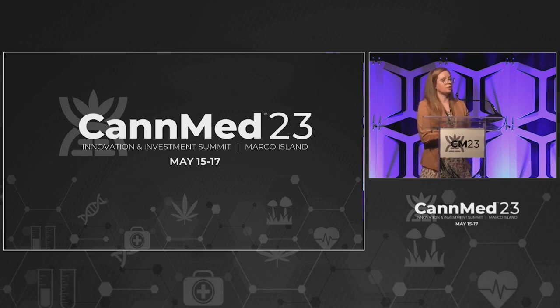And I think that's why more research ultimately needs to be done before we just put a ton of RadSource product on the market: what is it doing to the product? Make sure it's actually solving the problem rather than just tricking the test, because there are dangerous molds that could be present. Aspergillus could be present, and RadSource could allow that colony not to grow, but the Aspergillus then broke down into mycotoxins that now you're inhaling. So there's so many different pieces to the puzzle that I think the whole picture needs to be addressed.